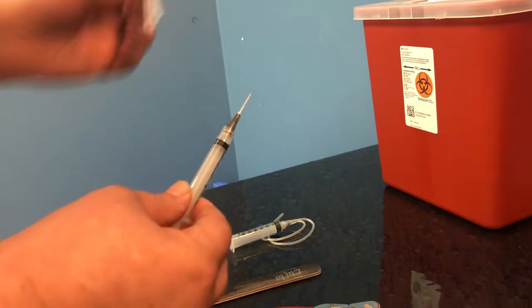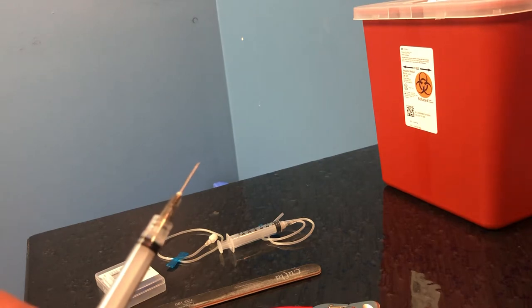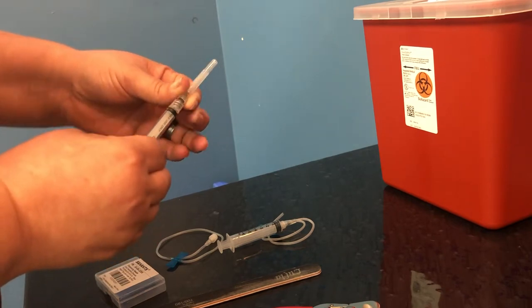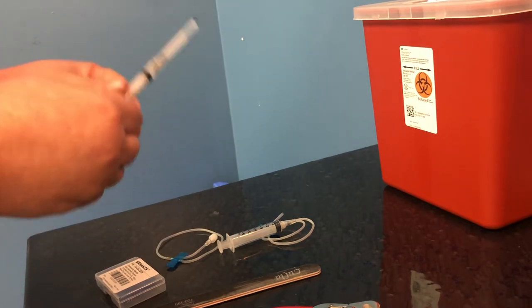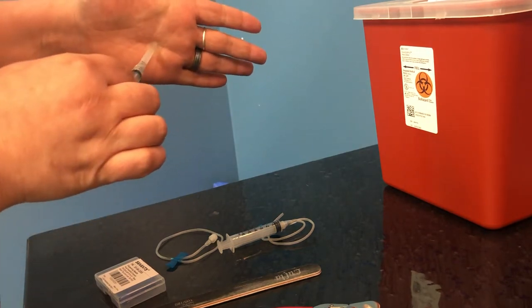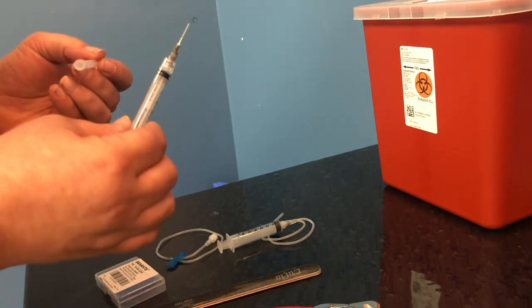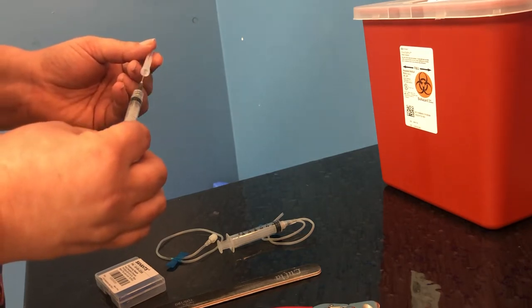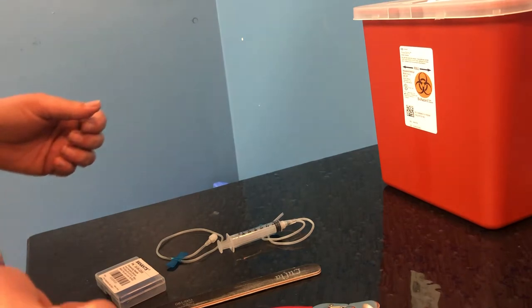The difficulty with that is that if I do take the cap off the needle, and you can see just how small and sharp that is, it's not necessarily a very accurate representation for the animal of what that stimulus is going to feel like. And we need to have a whole bunch of approximations that we can do between nothing and an actual injection. The approximations between here with a capped needle or a finger or another prop and here where we have an actual sharp needle, it's a really large jump. And many animals I was finding would adversely react when we actually did an injection with a real needle. To help solve that problem, I wanted to split that stimulus down into smaller approximations.